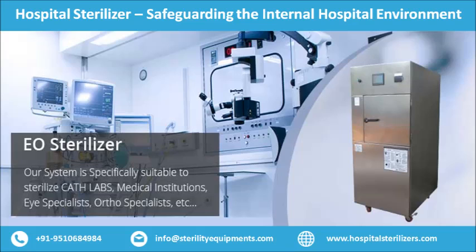In the third phase, the exhaust phase, the vacuum system vents out the gas from the chamber to outside. Most ethylene oxide gas sterilizers revive the chamber with fresh and filtered air to prevent extra gas buildup from the items that are degassing inside the chamber. The sterilized contents are then aerated to remove any ETO residue inside the sterilizer chamber.